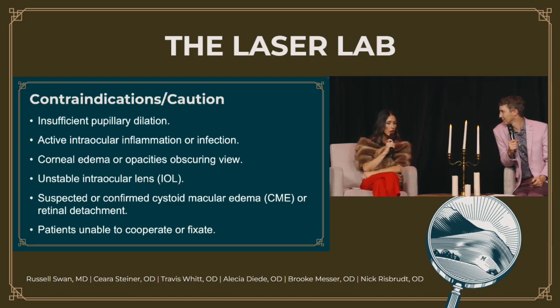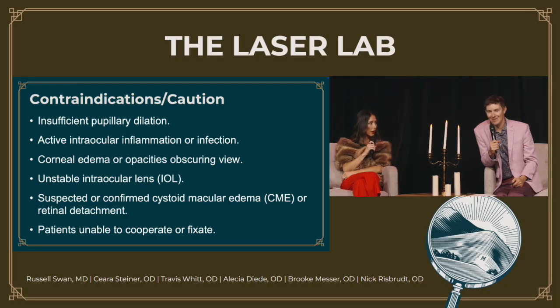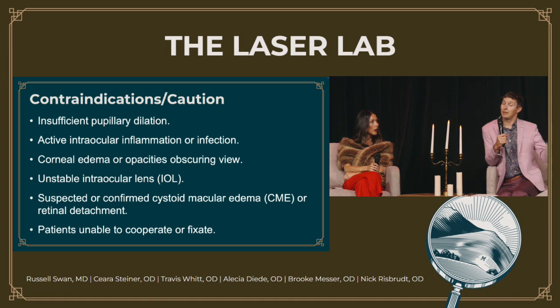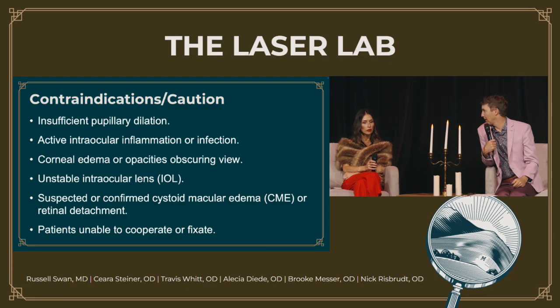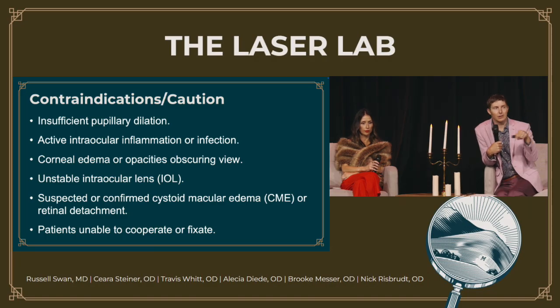How small would you say is too small for pupillary dilation? Because I don't know that you've ever sent one back down saying you won't do it or can't do it. Yeah, there are different thoughts even about how big the YAG opening should be, whether it's 3 millimeters, 4 millimeters, 5 millimeters. But again, I think if you can, in essence, clear their scotopic pupil size, then they're going to be really happy. So that, to me, is the bigger thing. And again, somebody who's a poor dilator is also a poor dilator when it comes to scotopic light settings. So even just clearing their central visual axis in that setting is a very nice thing.